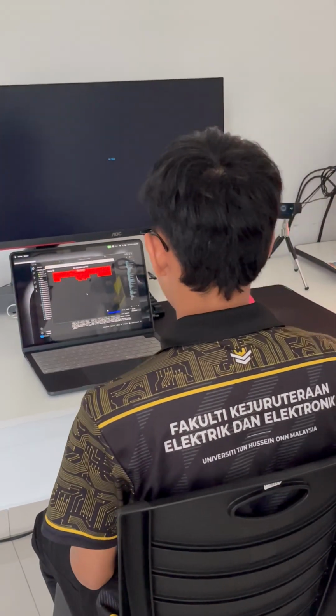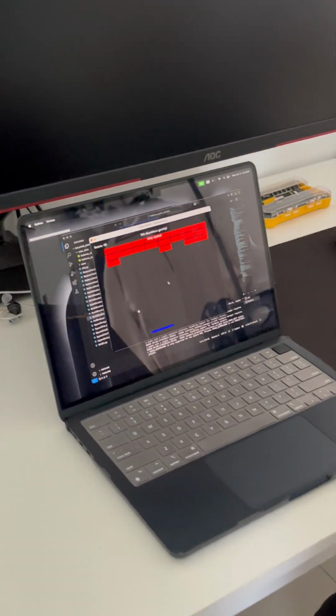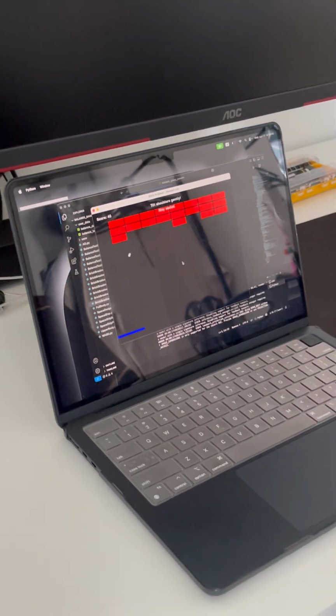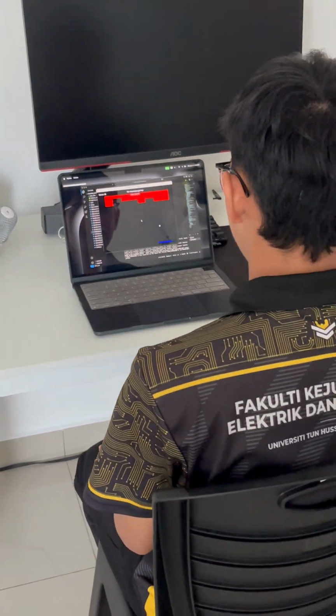Okay, so initially, the camera on the device will detect the shoulder. The detection will then indicate to MediaPipe from the VSC to control the blue paddle on the game. For more information regarding this first game, we were unable to collect data from the game. Because of that, we created another game that can collect data to trace the person's balance body.